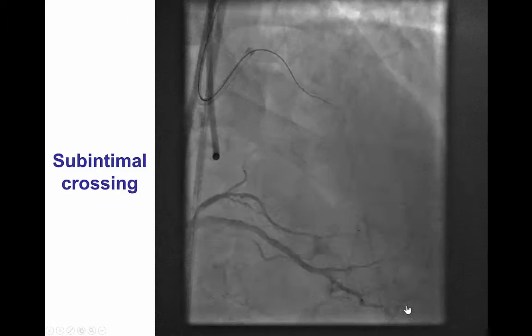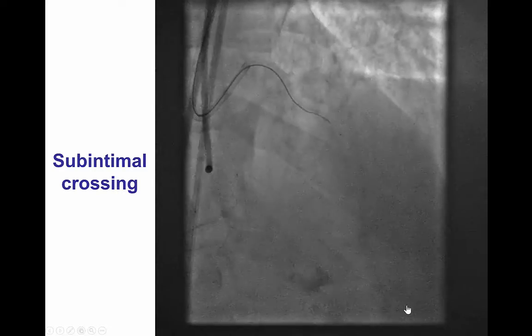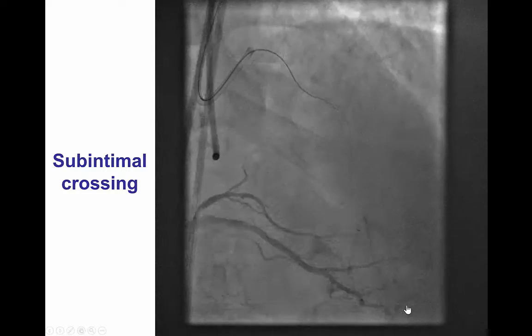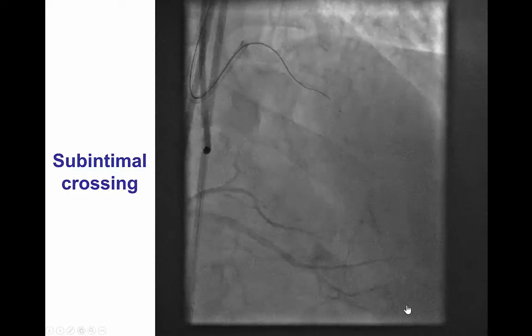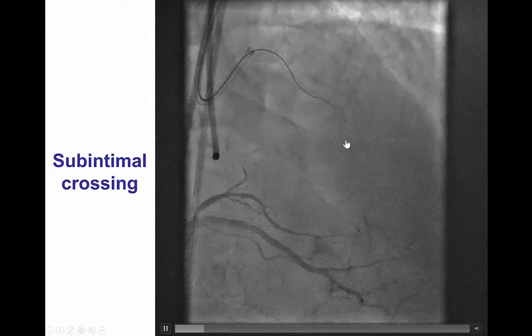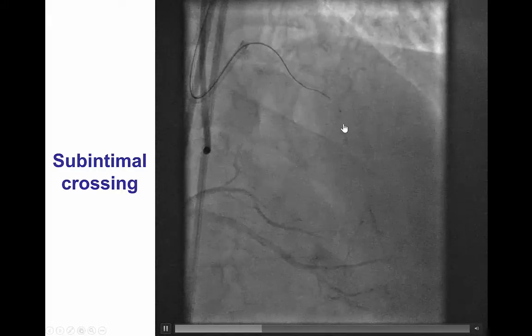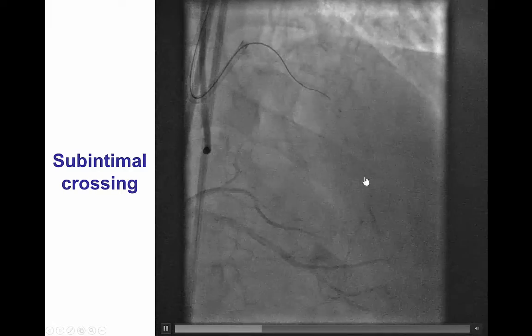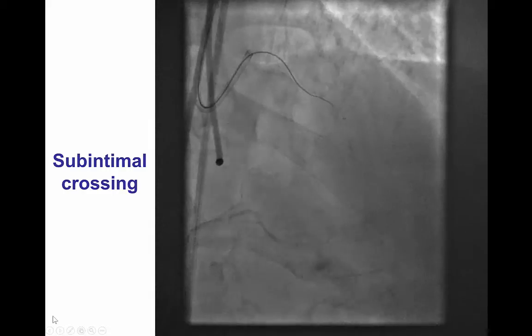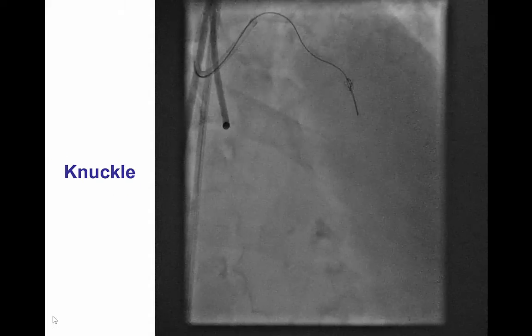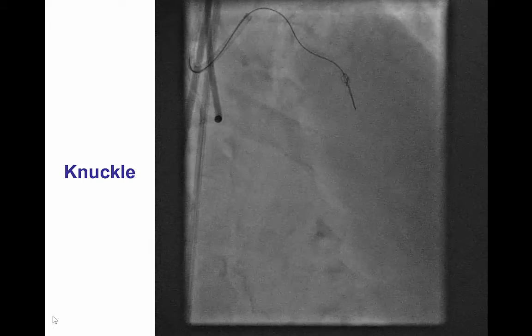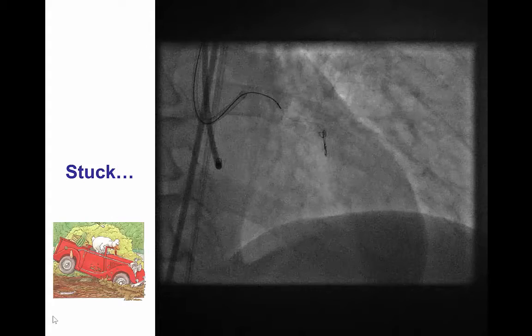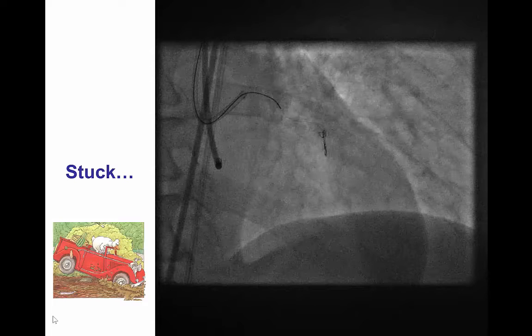However, upon further advancement, it became apparent that although we were dancing in sync, the microcatheter and the wire were actually in the subintimal plane. Given that there was not much reconstitution of the vessel in the mid area, the goal was to advance a knuckle wire further down to the LAD and attempt reentry at an area where the vessel reconstituted better. The Fielder LXT guidewire was advanced and pushed into forming a knuckle guidewire. However, the problem was that the knuckled wire subsequently became entrapped and could not be withdrawn back into the microcatheter.